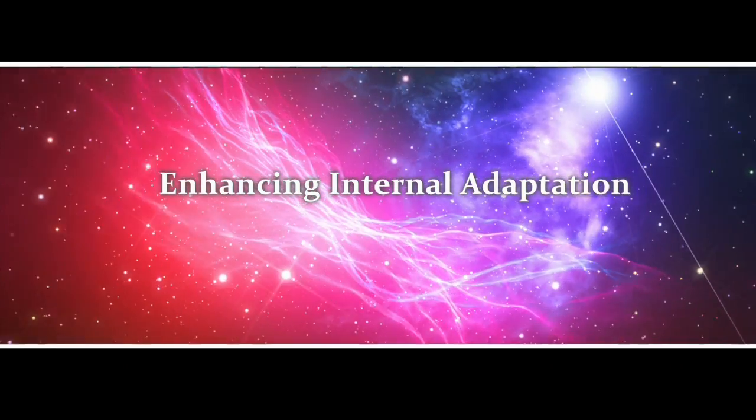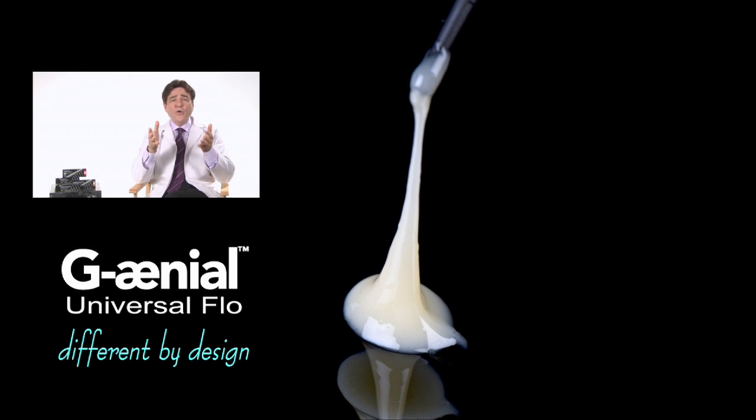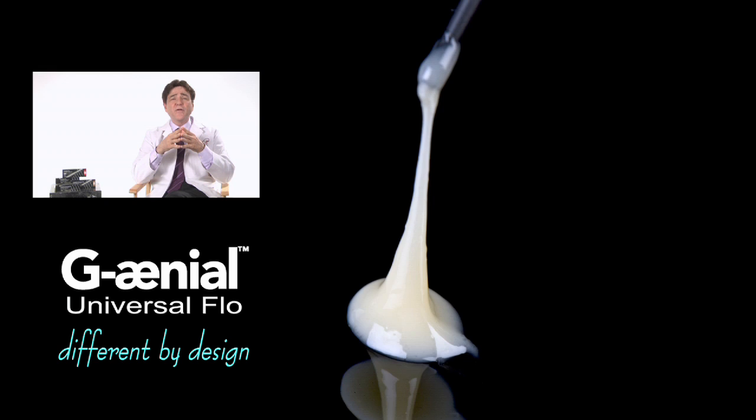To enhance internal adaptation, these next-generation flowable composites, such as G-aenial universal flow, are 69% filler by weight, with an average particle size of 200 nanometers.